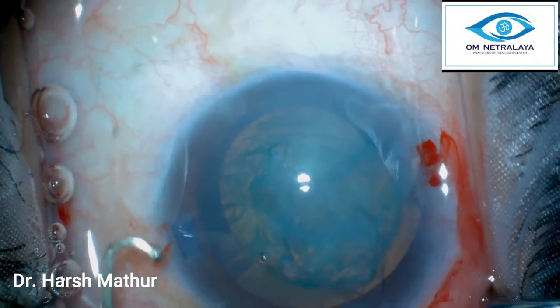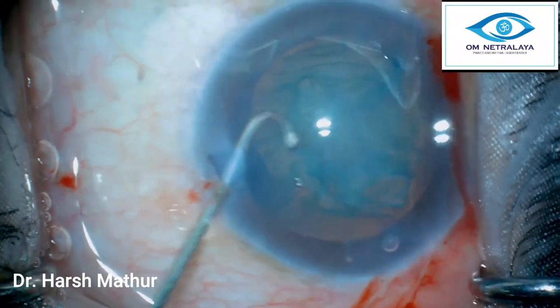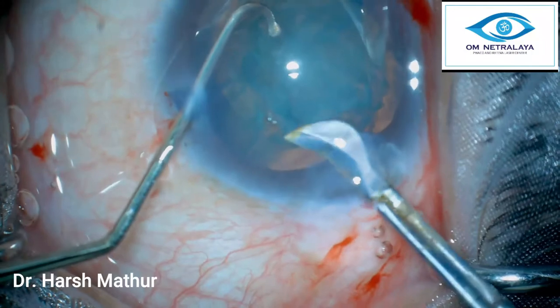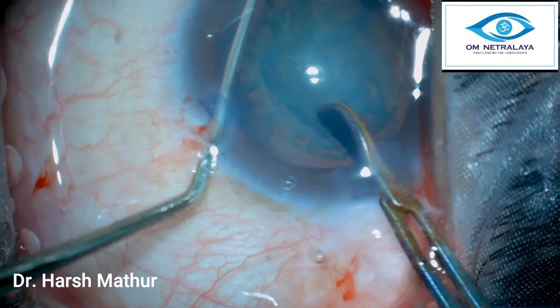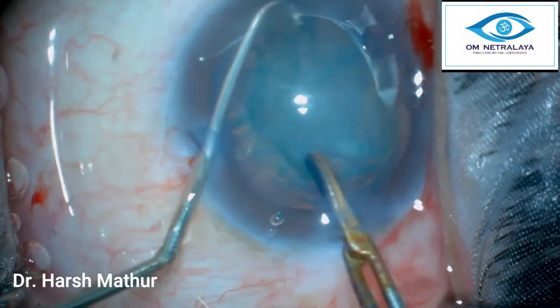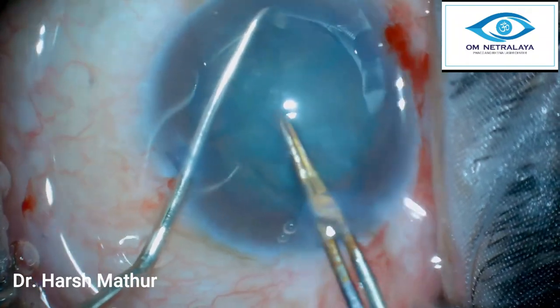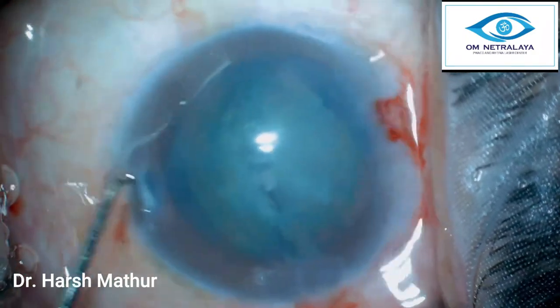Now is the time to take the pre-chopper in. In the left hand I have a long ball-tipped chopper, and this is the Akahoshi pre-chopper. With the tip down, I can see the rhexis being stretched as I take this large chopper inside. Carefully I hook the nucleus, gently take the sharp edge of the pre-chopper to the center, and gently separate — giving a good division into two hemi-nuclei.